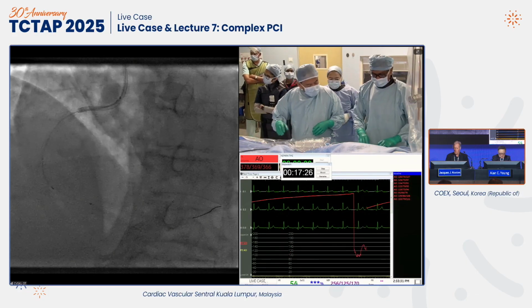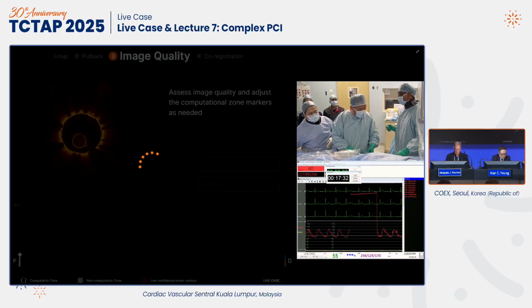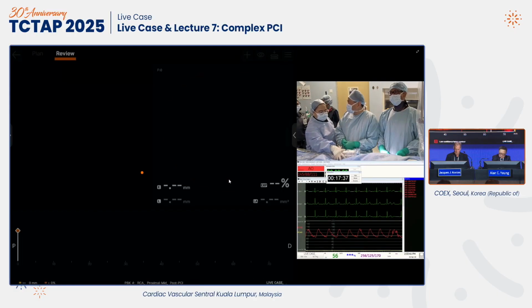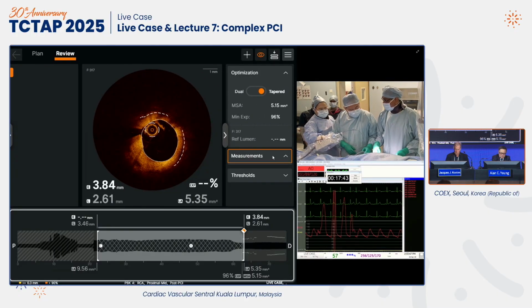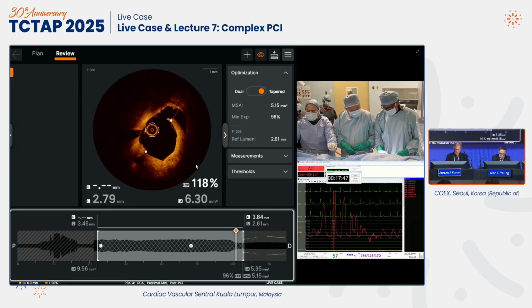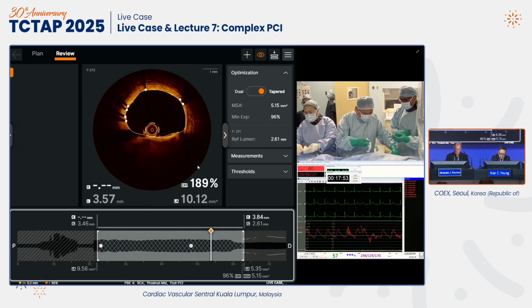So deliverability, but the most important thing, it comes in many different sizes from 1.5 to 2, 2.5, 3, 3.5, and eventually 4. And you can use it as many times as you want. The other thing is it works for calcium arcs which are less than 180 degrees. And it does work for calcific nodules that we have seen. So that is probably the advantage, and reusing it in the same patient, in the same artery.